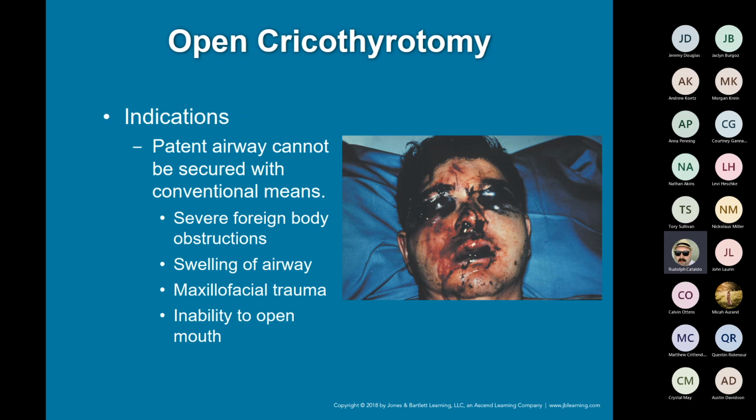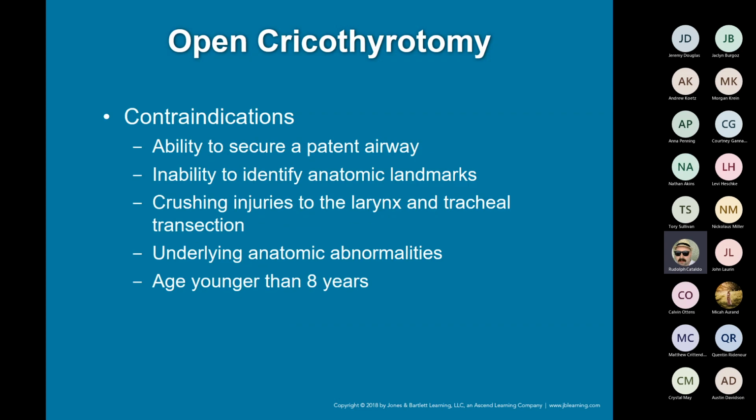If I need to create that opening, it is a bad day. There's a lot of things happening at this point to where we are literally having to create a new opening in somebody's windpipe. It's not good by any means. It's not something we do very often. It's not something we are 100% proficient in, but we should know the anatomical landmarks and what we are looking for, because in the instance you need it, you need it. There's no time to mess around. If you need to do a quick crike or a needle crike, then you need to do it at that time.